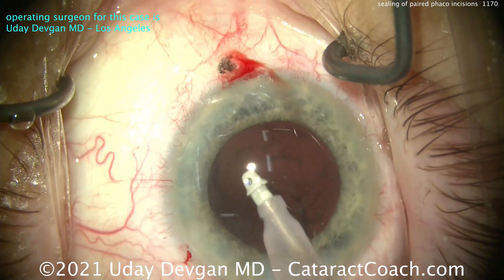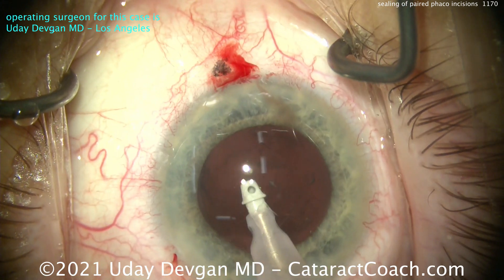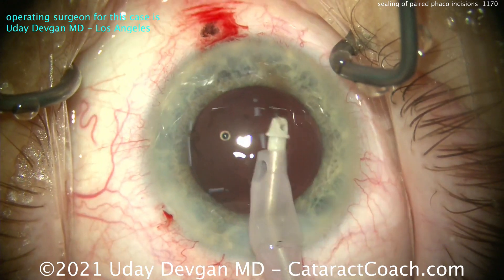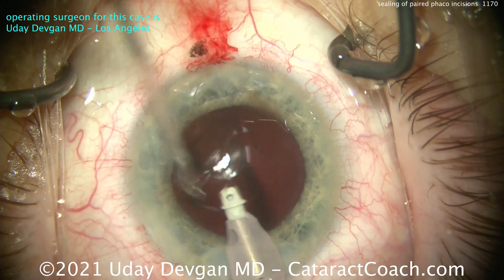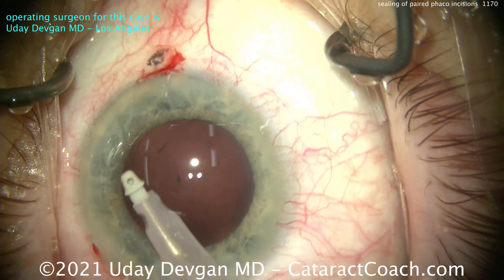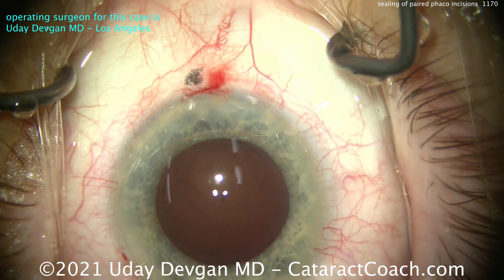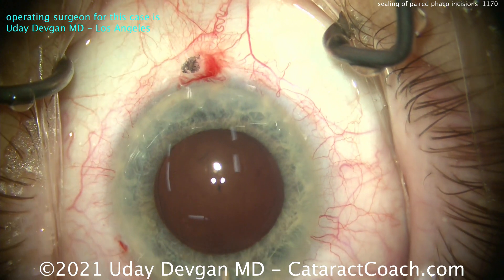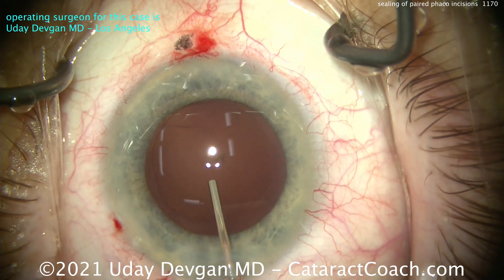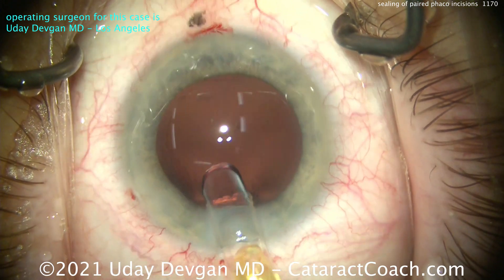With an intraocular pressure of around 70 millimeters of mercury — and normal eye pressure is 15, 16, 18 — this is four or five times higher pressure. And look, there is no leakage from that incision. You don't actually have to touch that incision. You don't have to seal it up, hydrate it, or worry about it. If it's created properly — which it was, because we saw it being created — it's going to seal beautifully. The main incision you're going to have to hydrate at least a little bit, because we've used it so much.